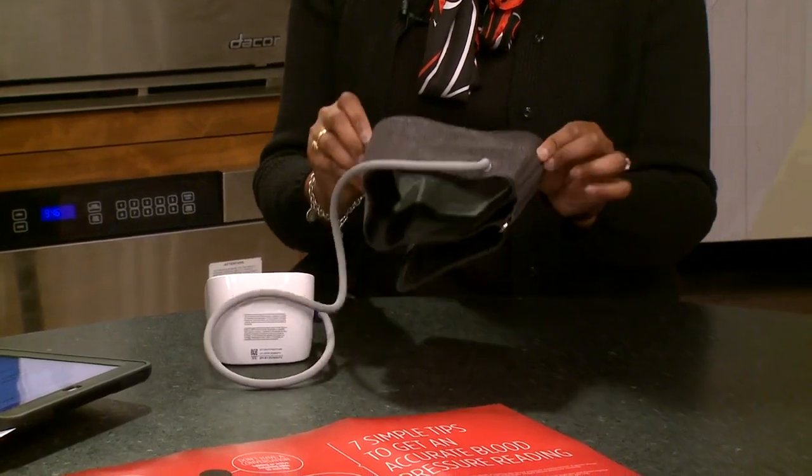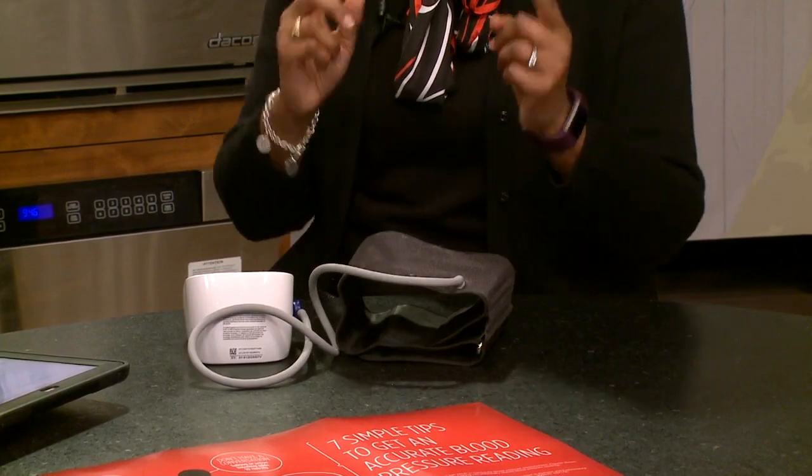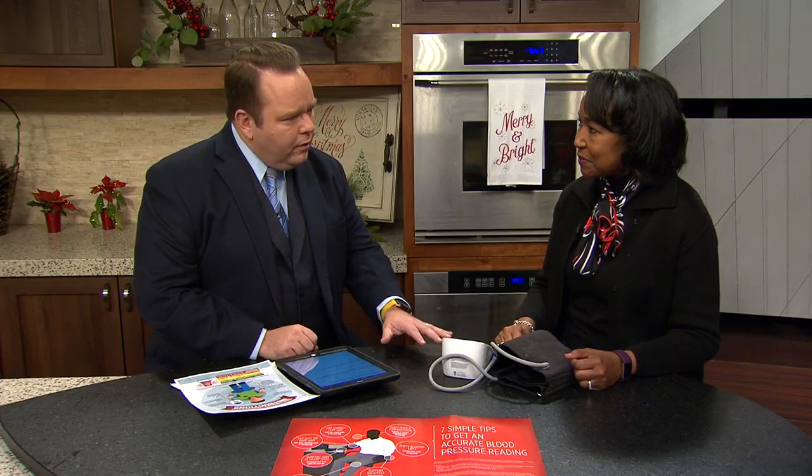Secondly, you want to make sure that you have the right size cuff. The cuff part that blows up should at least go around 80% of the arm. So for individuals who have a much larger arm, the cuff that comes with the monitor may be too small. You need to check with the pharmacist to make sure that there is a larger cuff. If you have a very large arm, then it's okay to use a wrist blood pressure monitor, but keep in mind wrist monitors can be a little temperamental.